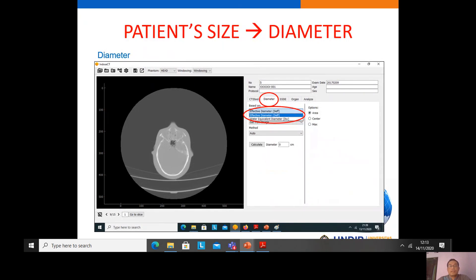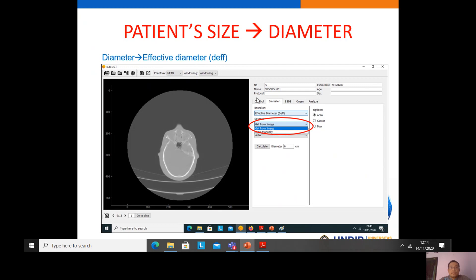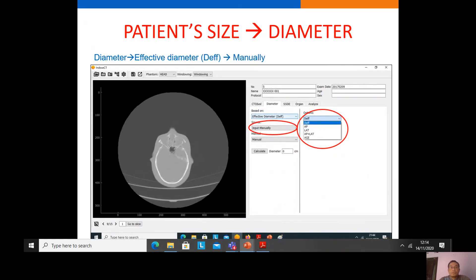The second feature of the software is to estimate the patient size or patient diameter. The patient diameter is characterized by two metrics: effective diameter and water equivalent diameter. We can choose either one. If we choose effective diameter, there are two options: from the image, or without image (manually). Without image, there are options including effective diameter, AP diameter, lateral diameter, AP plus lateral diameter, and the age of the patient.